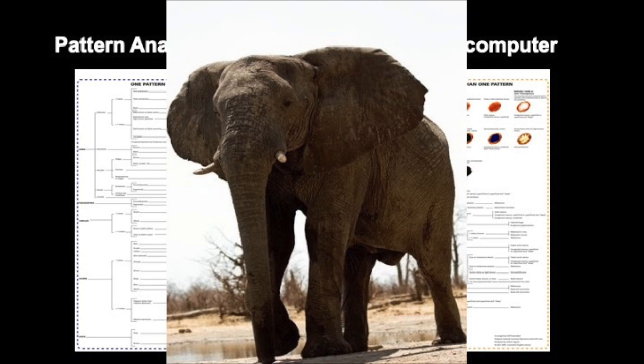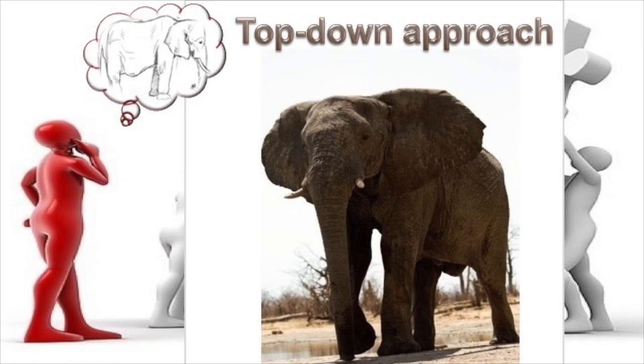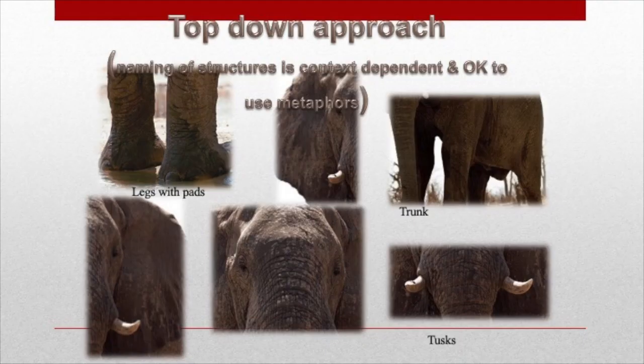The non-analytical is a little different, and I do think that most clinicians actually act on the non-analytical side of things. And that is, I think this is an elephant, okay? I think it's a basal cell, all right, whatever. And now I'm going to say, yeah, it is an elephant because I see these different features, right? So I can describe why it's an elephant. And similarly, I think it's a basal cell. Let me tell you why it's a basal cell based on what I'm seeing.